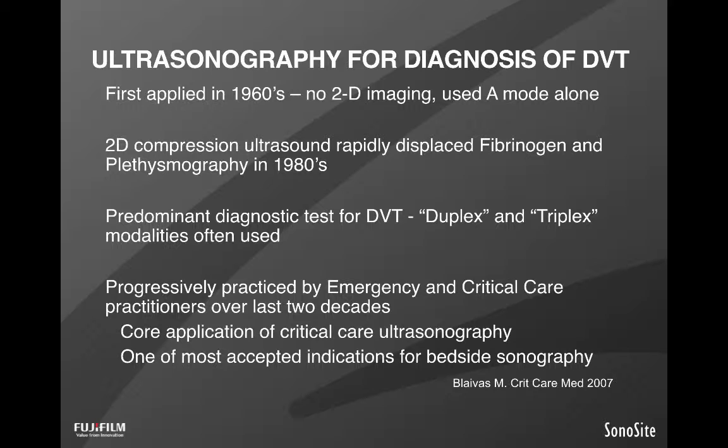I'll say the emergency medicine physicians use it more to get rapid answers so that they can triage their patients, whether their patients need admission, follow-up, or can be discharged immediately from the ER, whereas our utility for doing it in the ICU is variable. Sometimes we see asymmetric swelling, especially of upper extremities that have catheters, sometimes of lower extremities, and then other times we're trying to reorder the probability that someone could or will have a PE in different pathologic states. So it's a very common indication for us to try to answer clinical questions at the bedside.